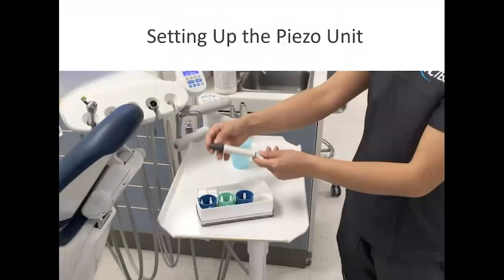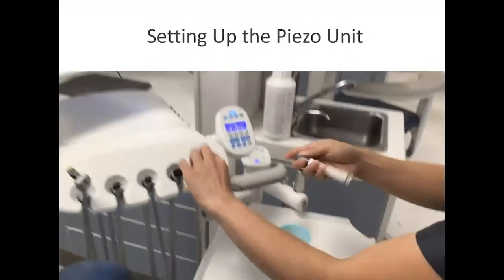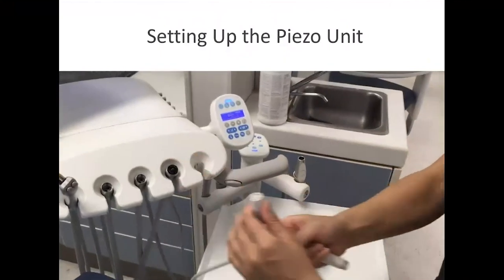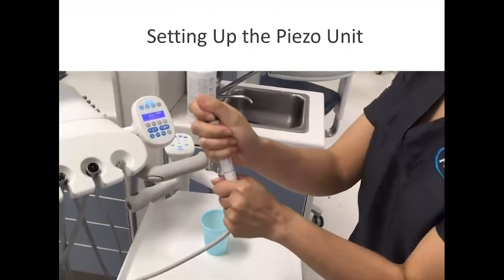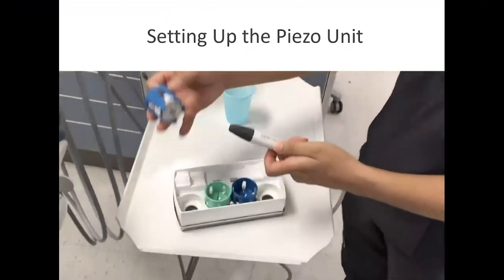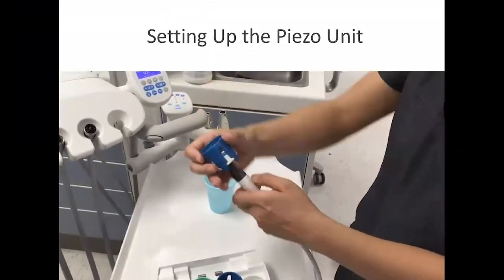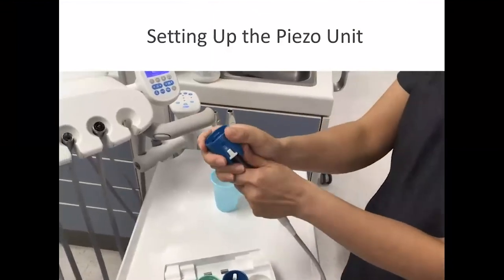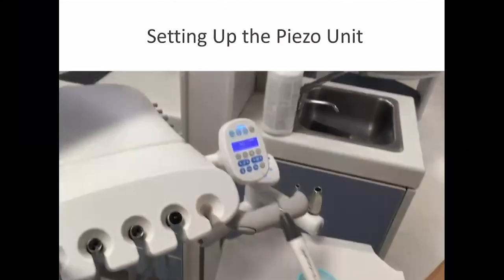Now let's take a look at setting up the piezo unit. The clinician is doing a demonstration here — of course, you would be wearing personal protective equipment — snapping the handpiece dot to dot. Now applying the tip: the tips are in the wrench, turning and pressing, and very carefully removing the wrench so as not to bend the tip.